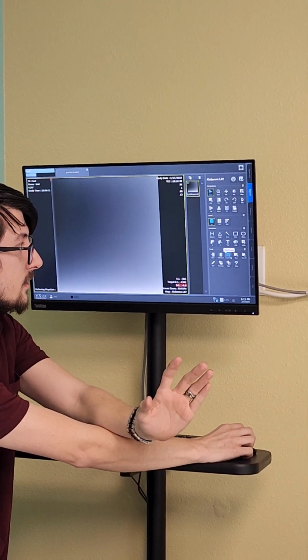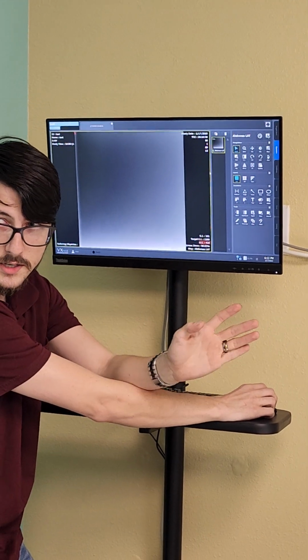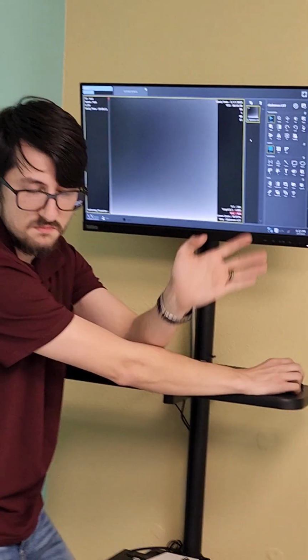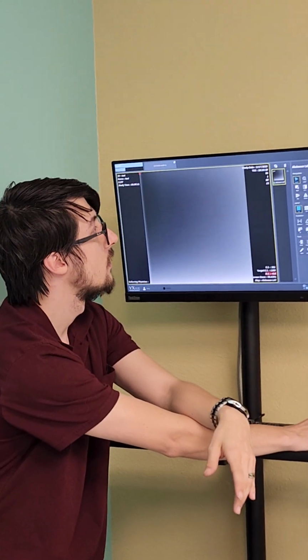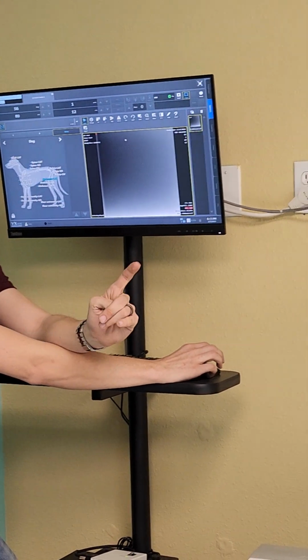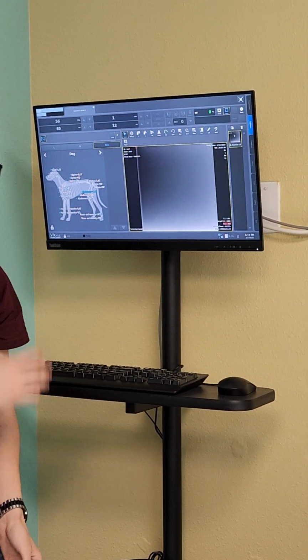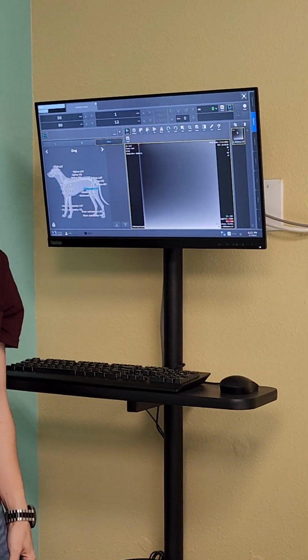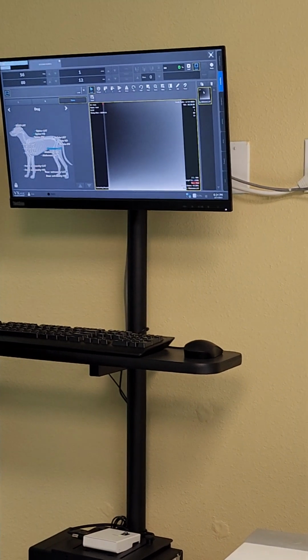Reject is if you took an image but it's not to your liking, and you don't want to send that to your PACS system. It's no good and it has artifacts, whatever. You would hit reject. Does that delete it from this system? It does not delete the images. It saves the image, it just doesn't send it anywhere else.